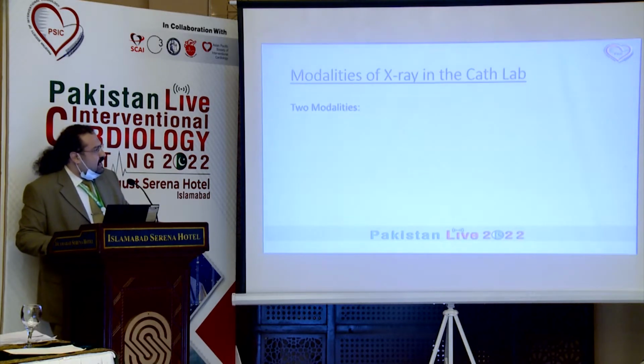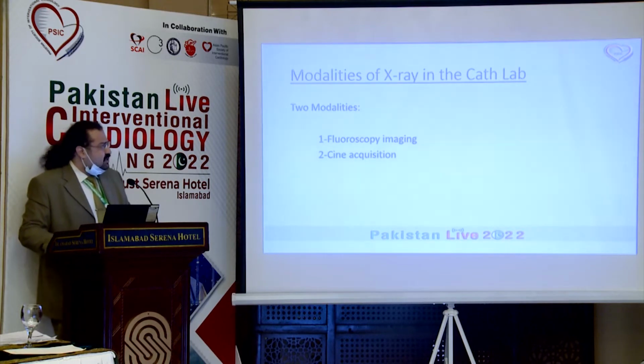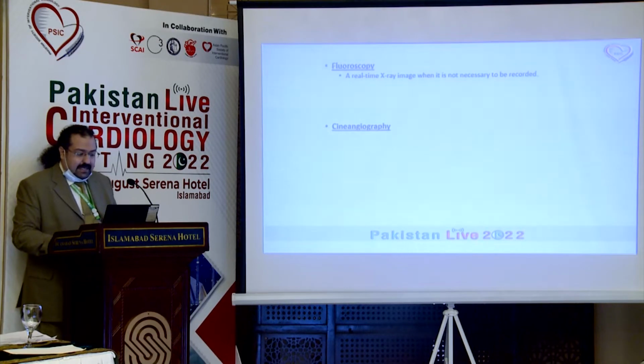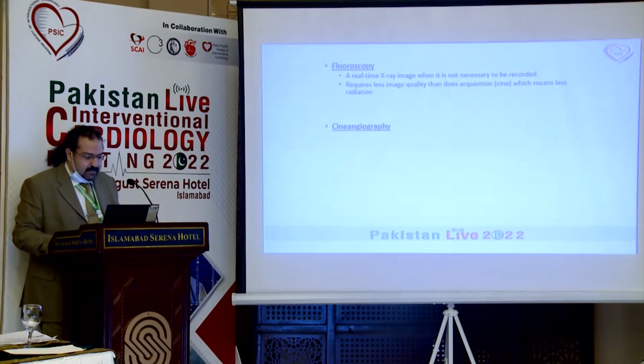Regarding the modalities of X-ray, everyone knows about fluoroscopy and cine acquisition. What is the main difference between them? Fluoroscopy is real-time imaging. While you are doing the procedure, it shows you what's happening inside the patient's body, and it needs a lower dose of radiation.